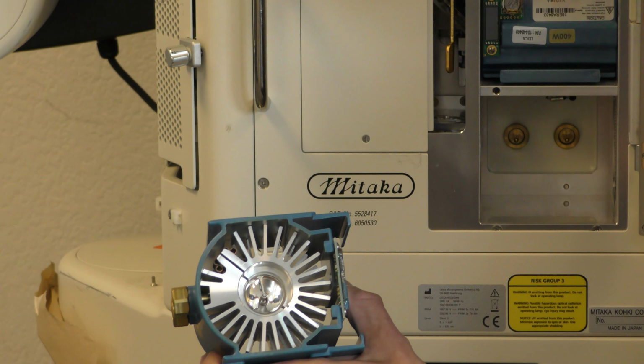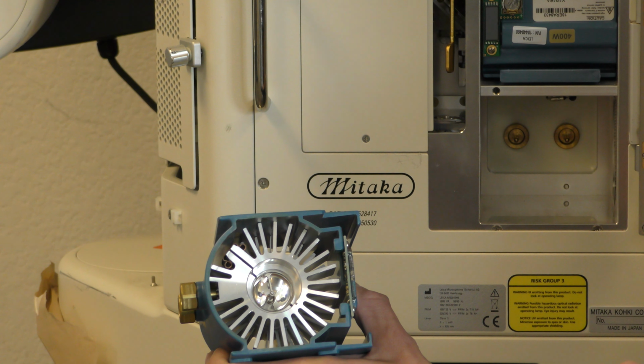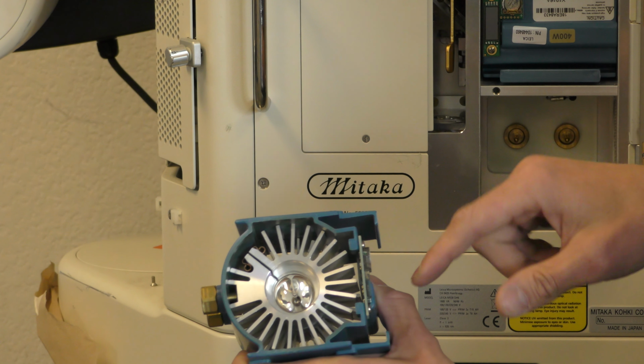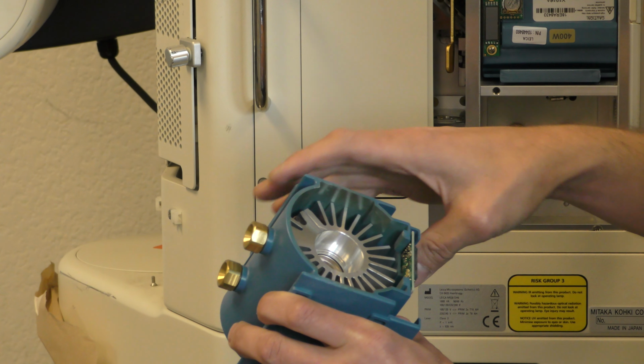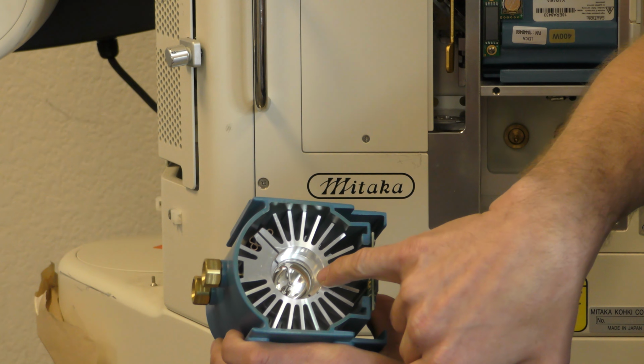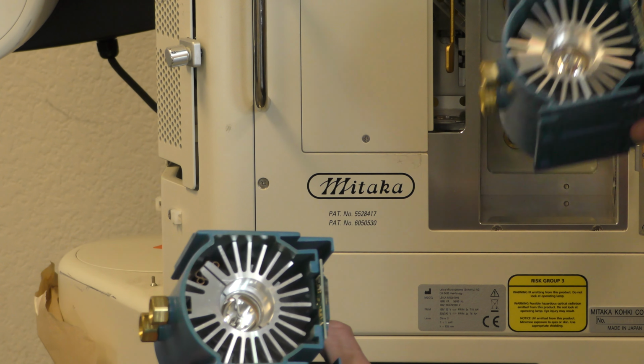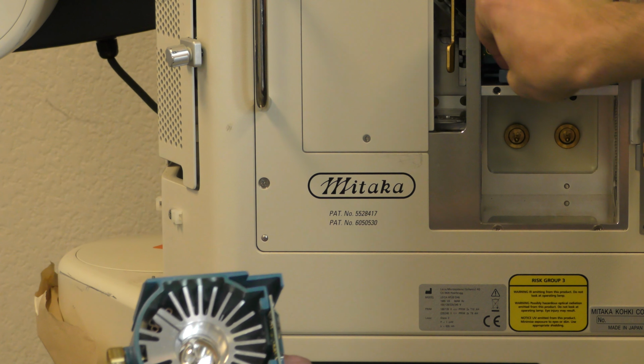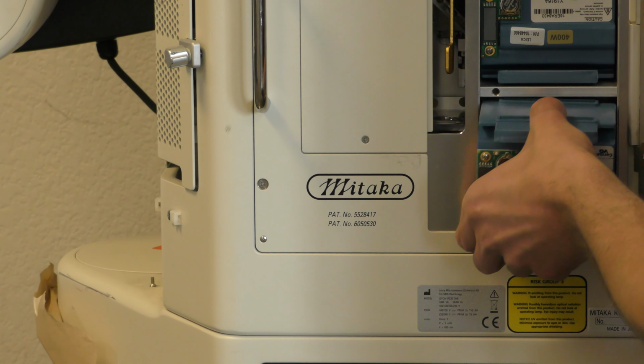But I'll take it the next step further. So I check that. If both of these bulbs, in this instance, have a little bit of dust, we have dead timers here. This one has very minor burning on the back end of the reflector, and this one doesn't have any burning on the reflector. So it's still a question, we don't know.